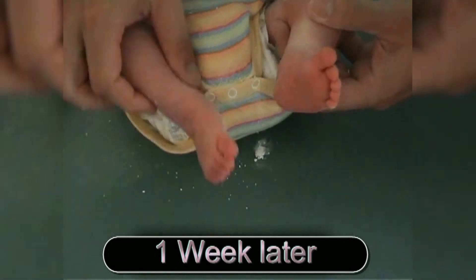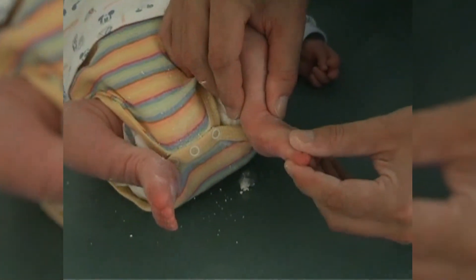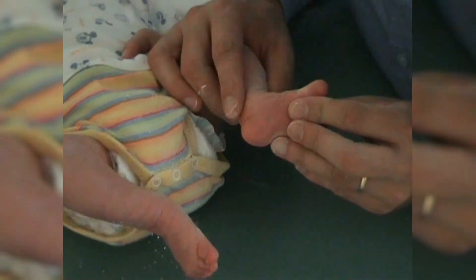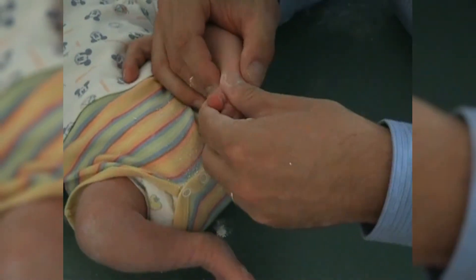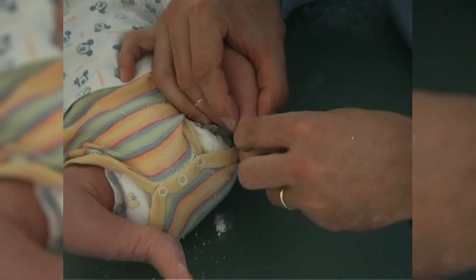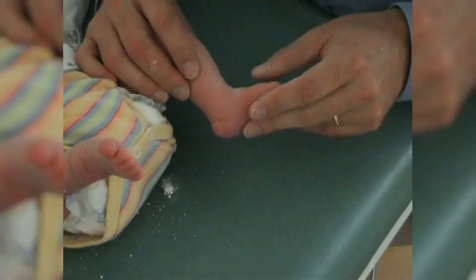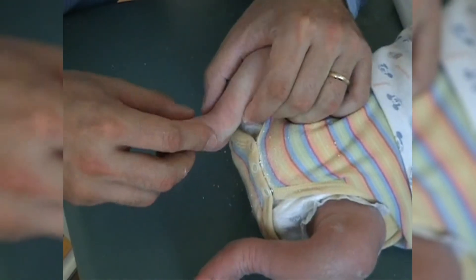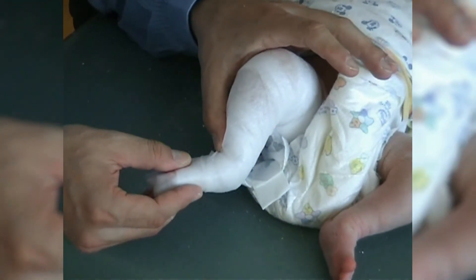After another week the casts are removed. Excellent correction results can be noticed with both feet increasingly abductable, now reaching about 30 degrees. Dorsal extension has also improved further. The adductus is corrected; the distance between medial malleolus and navicular has increased further. The heel pad is soft with a high calcaneal inclination. The third cast shows progressing abduction now reaching approximately 30 degrees on both sides.